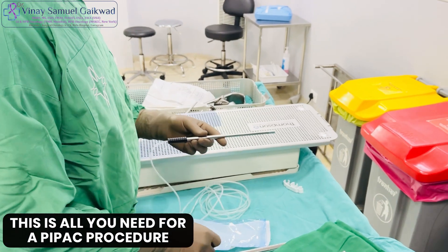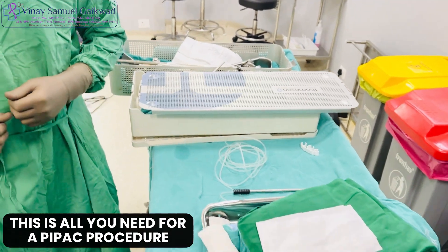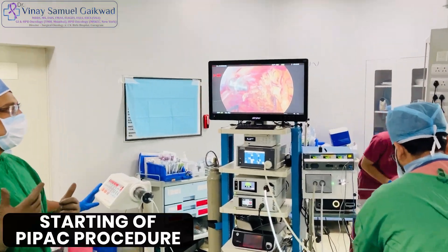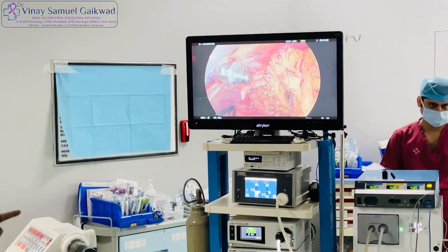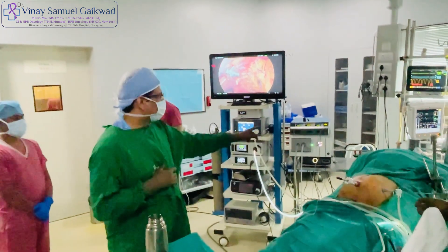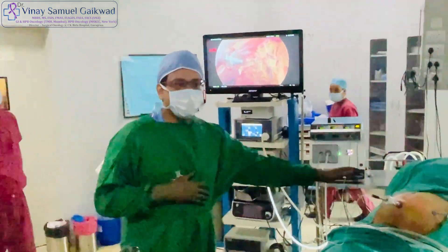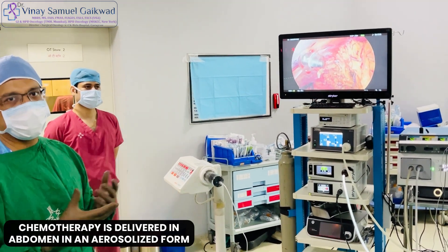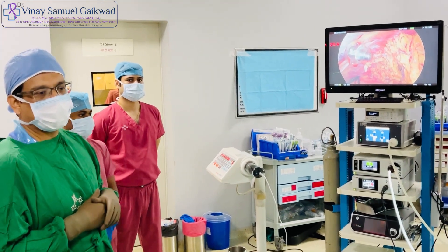So this sums up what you need for a PIPAC procedure, and once you have this set up you are ready to perform a PIPAC. We are about to start the PIPAC procedure. We have everything ready: the pressure injector, the laparoscopic stack, the balloon trocars, the smoke evacuator, and the capno pen, which is inserted. We will be delivering the chemotherapy into the abdomen through an aerosolized form so that we can kill the cancer cells through direct contact.